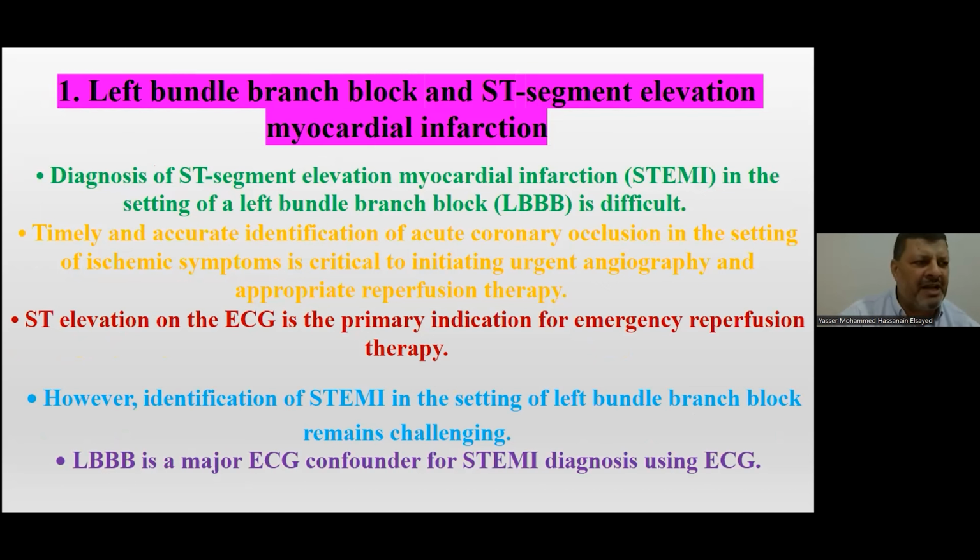Firstly, left bundle branch block and ST segment elevation myocardial infarction. Diagnosis of ST segment elevation myocardial infarction, or STEMI, in the setting of left bundle branch block is still difficult. Timely and accurate identification of acute myocardial infarction, or acute coronary occlusion, in the setting of ischemic symptoms is critical in initiating urgent angiography and appropriate reperfusion therapy.